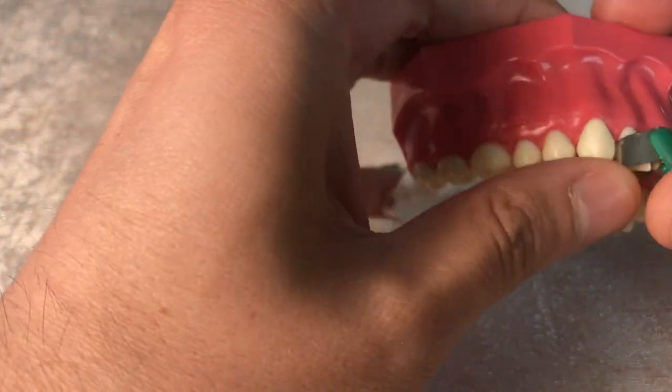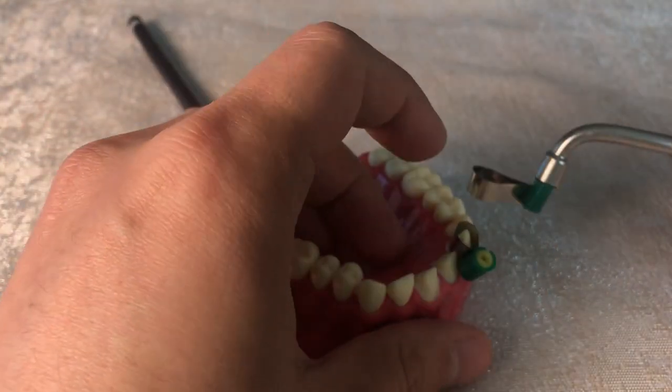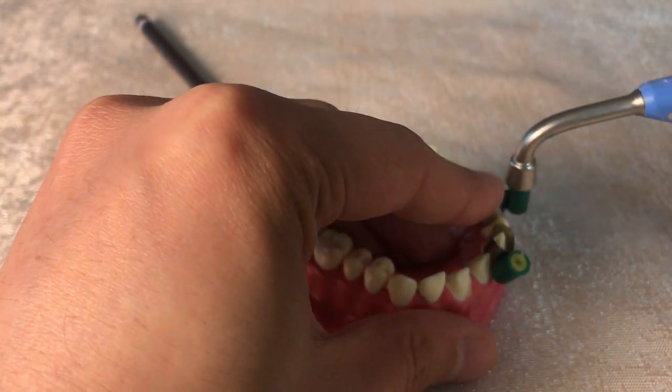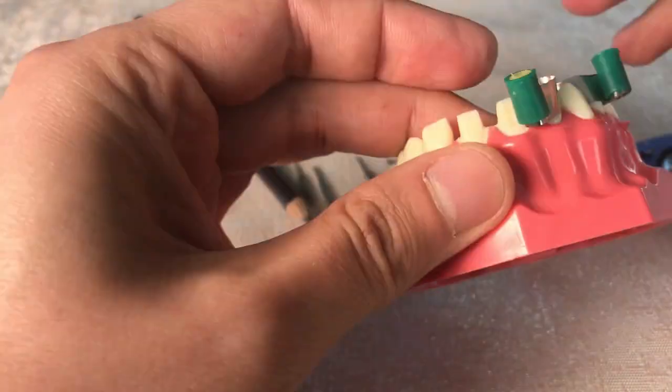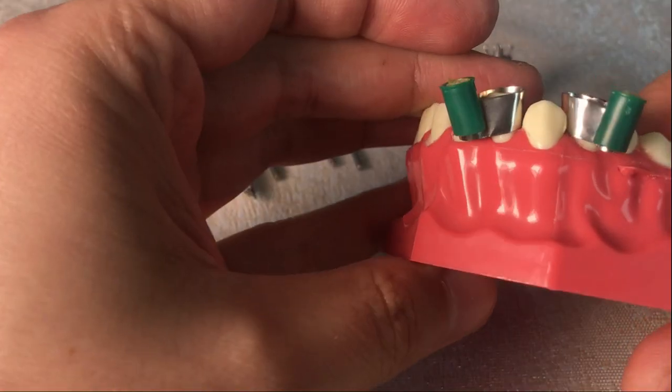You can see how to use the automatrix on the screen. When the ball on the automatrix is pushed, the matrix band leaves. By pulling the ball, automatrix holds the band. And by moving the ball left to right, the band loosens up or tightens.